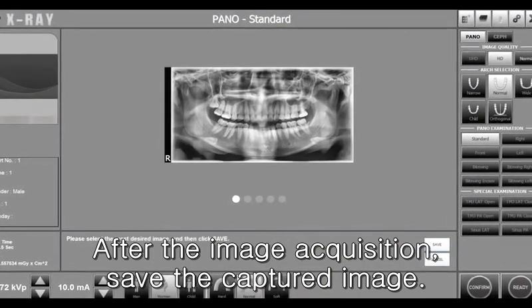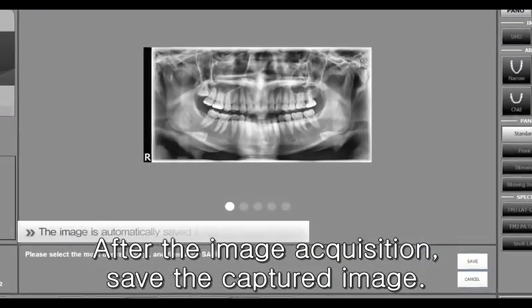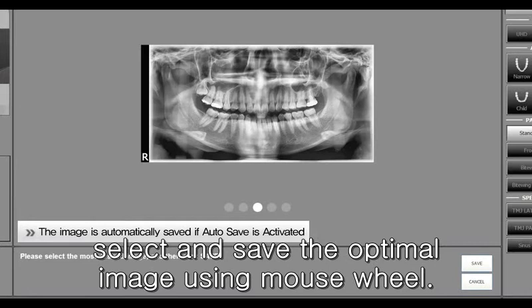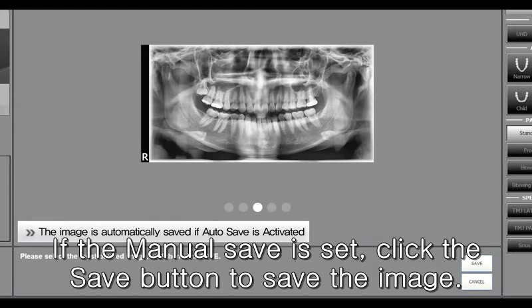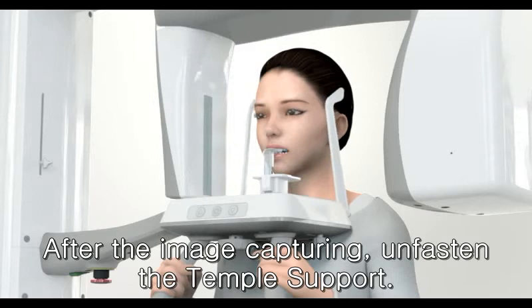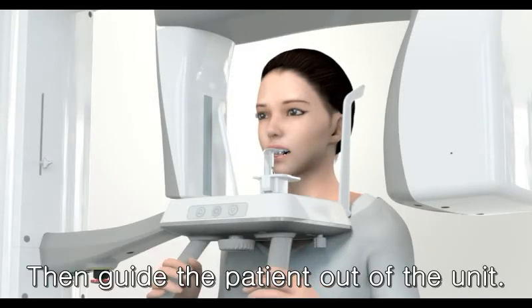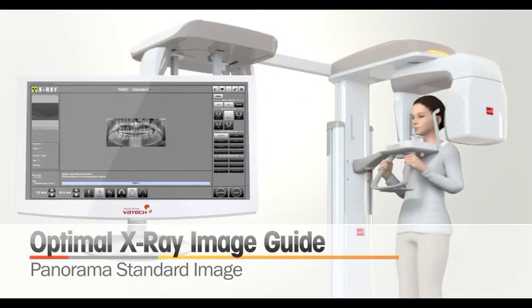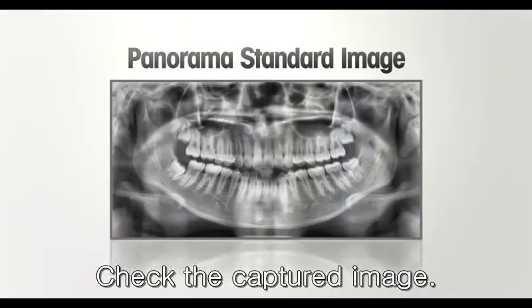After the image acquisition, save the captured image. If you purchased license of AF mode, select and save the optimal image using mouse wheel. If the manual save is set, click the Save button to save the image. After the image capturing, unfasten the temple support, then guide the patient out of the unit. Check the captured image.